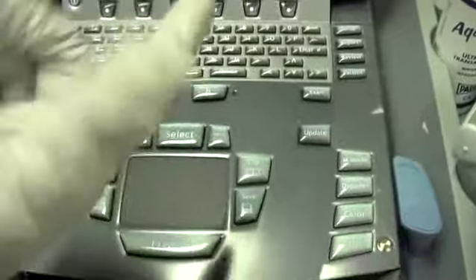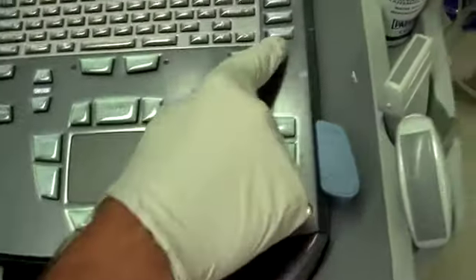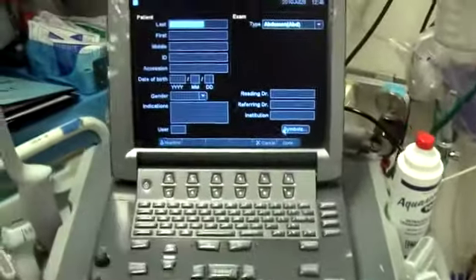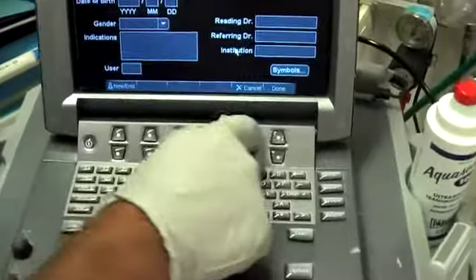And show me the patient info button again. The patient button is right there. Okay, got it. Thank you. And that gets you back to this screen. You can either manipulate the screen with this trackpad, or you can use these buttons along here, and they correspond to the soft keys on the display. Right. Good. Excellent.